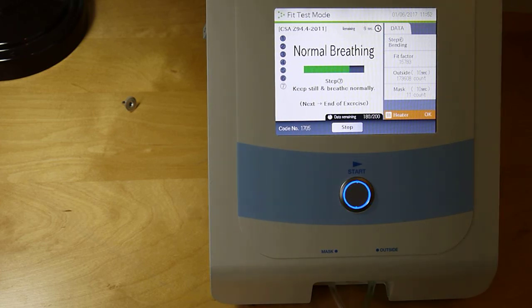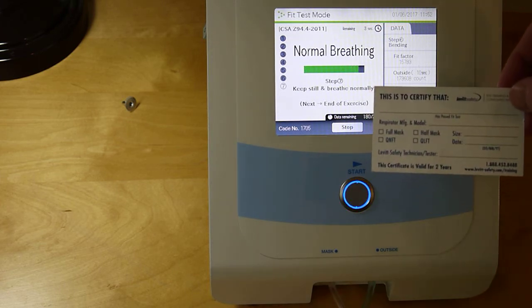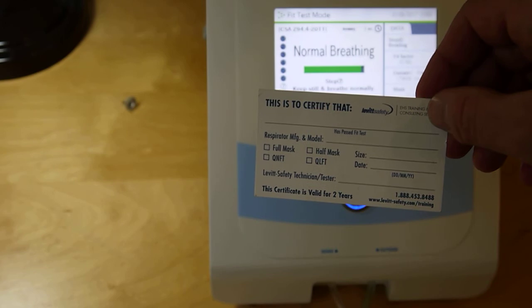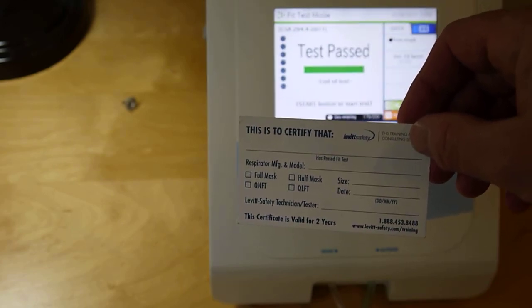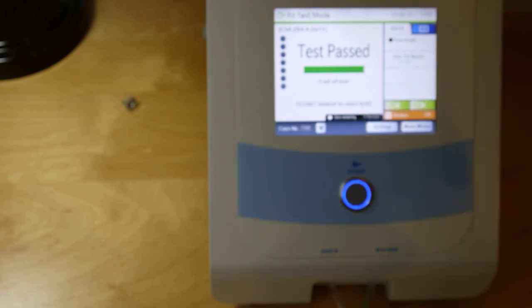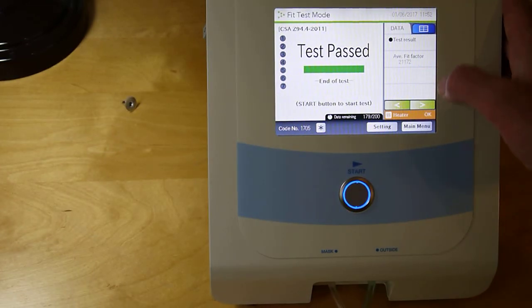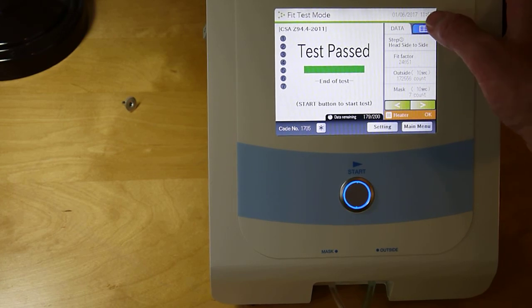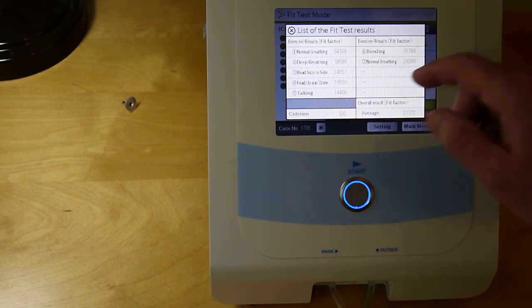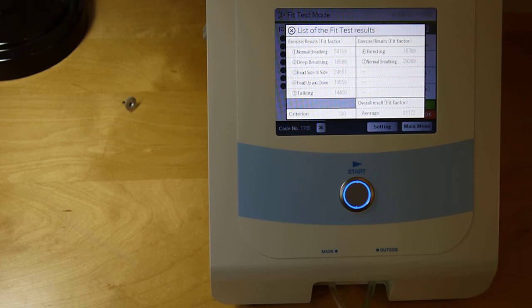The unit can hold up to 200 fit tests that can be downloaded to a computer. Some clients use style cards where they write the person's name and the respirator they're approved to use. The test is passed. You can step through each result individually, or view an overview that gives a summary of all the test results.